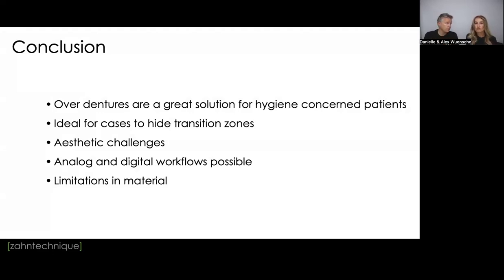Analog and digital workflows are possible, right? Or Digilog, right? Which is really cool. So nowadays we can almost solve every case in analog, Digilog, or fully digital workflows, with some exceptions, of course, right?